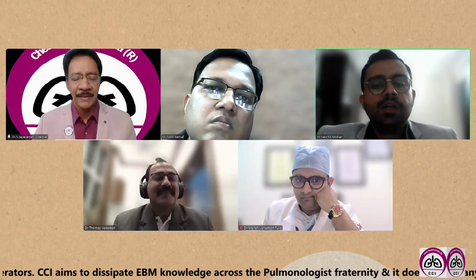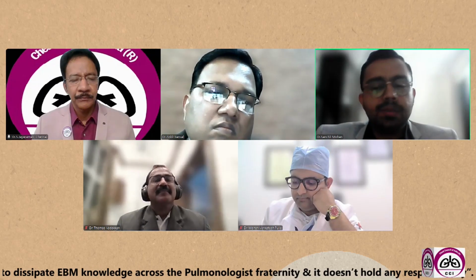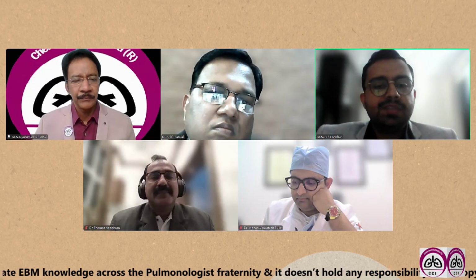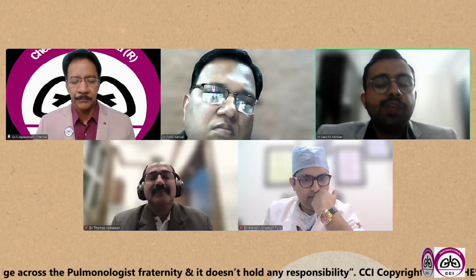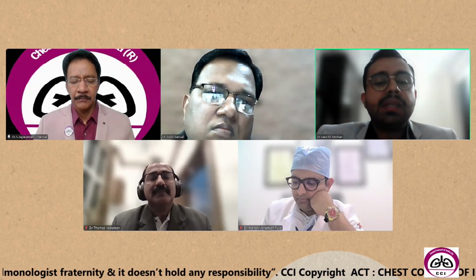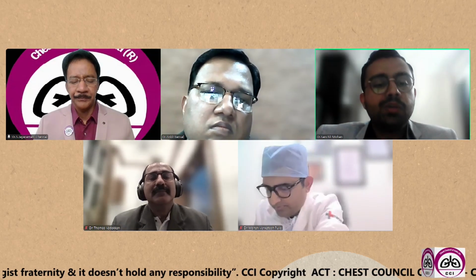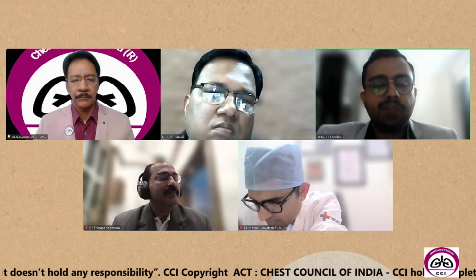Thank you, sir. If we talk about a diagnostic EBUS, suppose a patient comes with a CT scan that shows only the station 7 lymph node. What we have to do is screen all the nodes. We don't just rely on the CT scan, because many times the CT scan may not show a node, but the node may be present on EBUS when you do the ultrasonography.